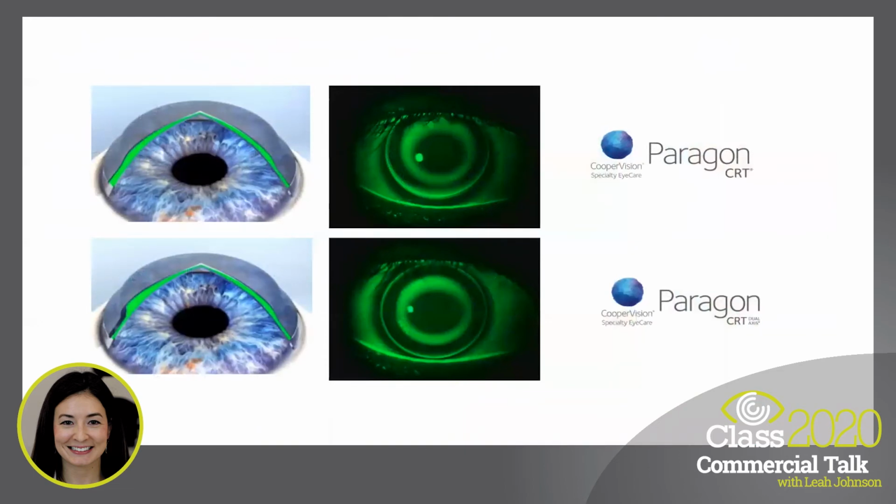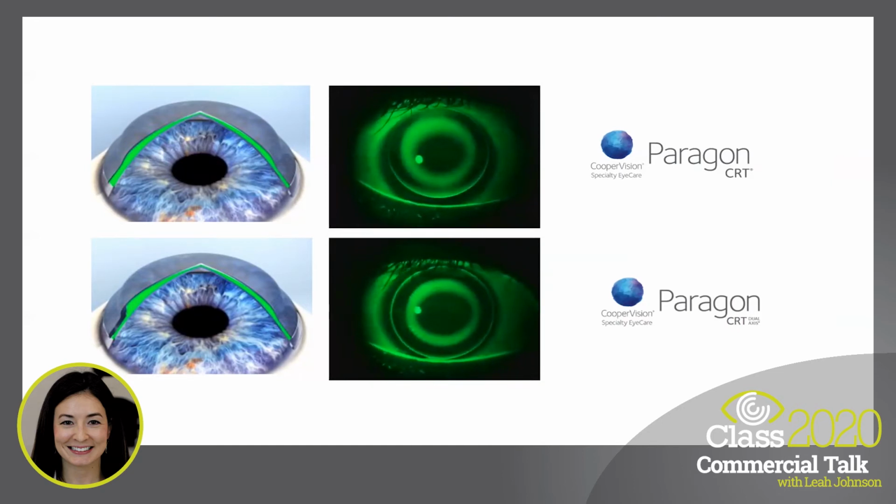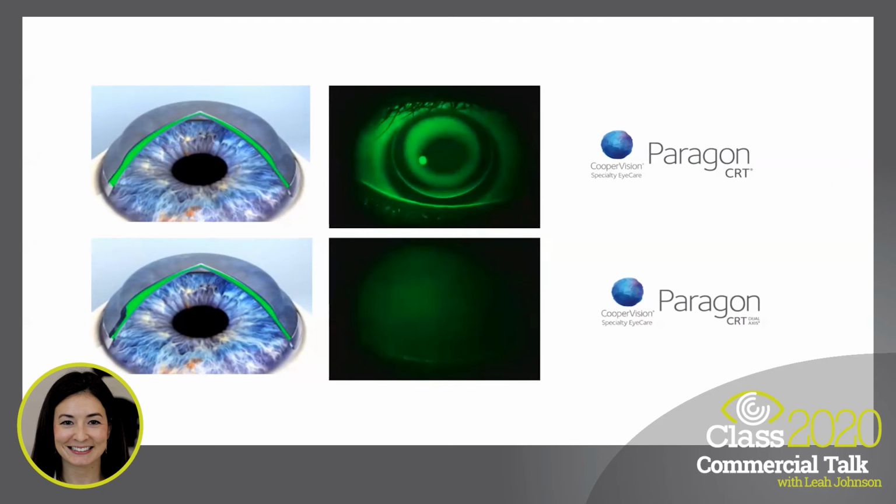So once again, here is a quick video summarizing a Paragon CRT spherical lens on a toric cornea. As you can see, we don't achieve complete 360-degree alignment in the mid-periphery, and therefore we want to use a CRT dual-axis lens with 2 RZD depth differences. And that secondary RZD2 with increased sagittal depth helps give us that nice 360-degree landing.